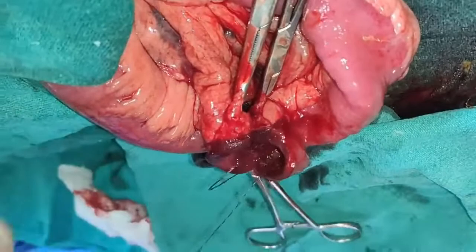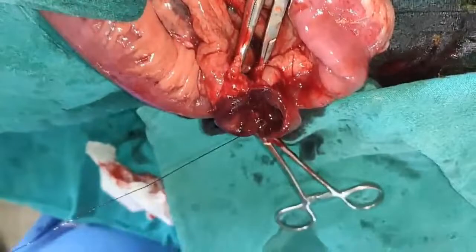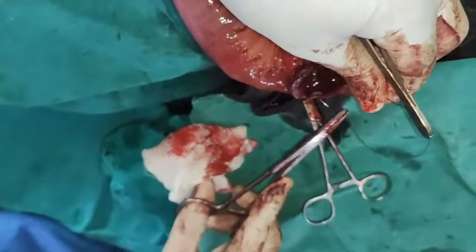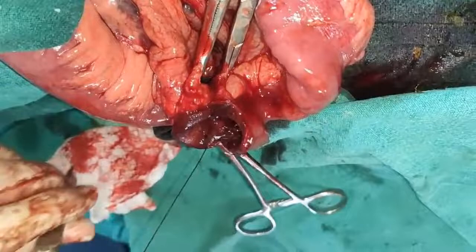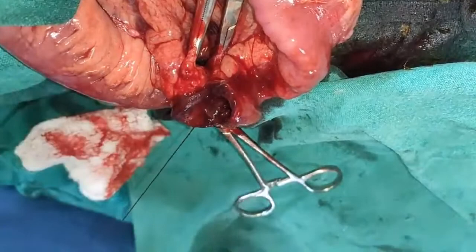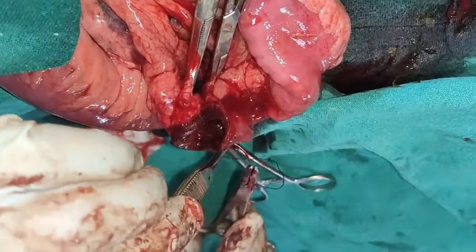I don't have the intestinal clamp here. But still, it can be repaired. The time increases because of the change in your intraoperative procedure. This one seems to be better, the intestinal lumen and all. Now you can see how quickly I can do it. Now the next half of the intestine is repaired from serosa to serosa.